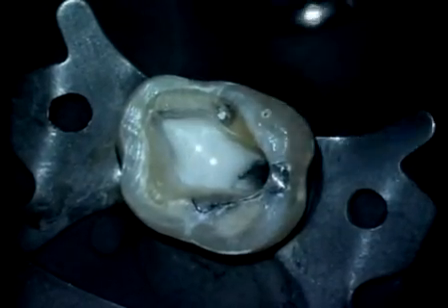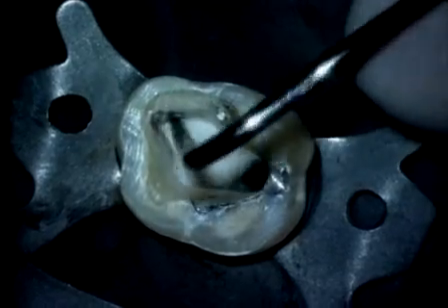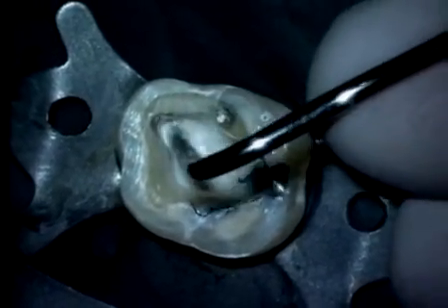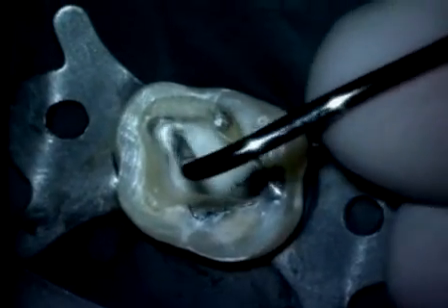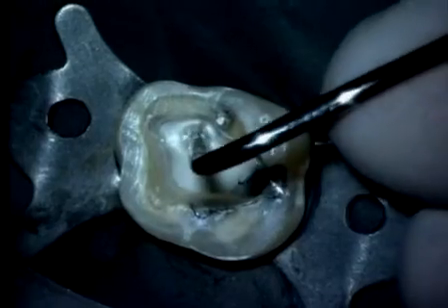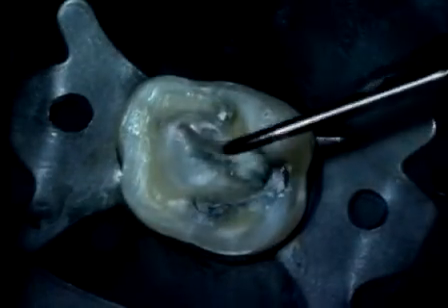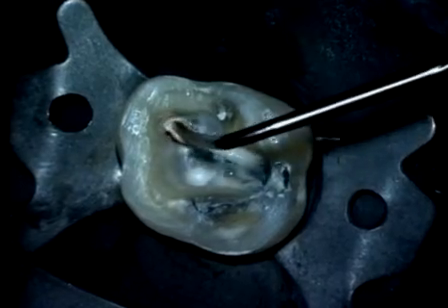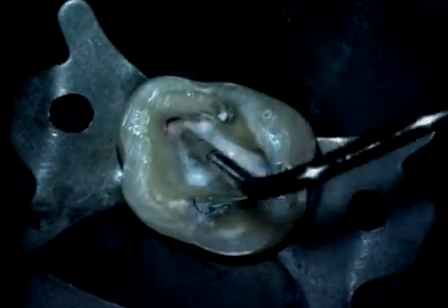Thermosoftened gutta percha has compaction potential. The pre-fit plugger is used to begin to shepherd and carry a wave of thermosoftened gutta percha into the cross-sectional diameters in the coronal 1/3 of the root. The touch and heat is activated and plunges into the mass. This removes another bite of gutta percha.